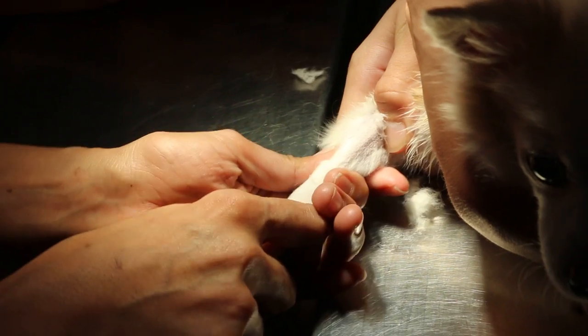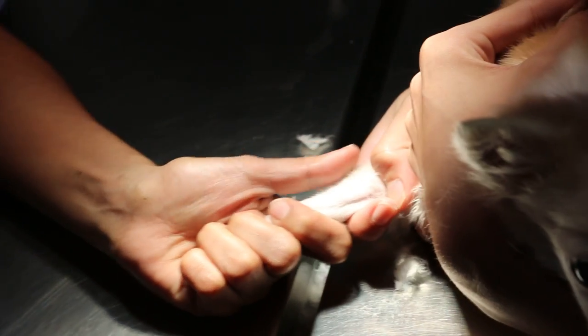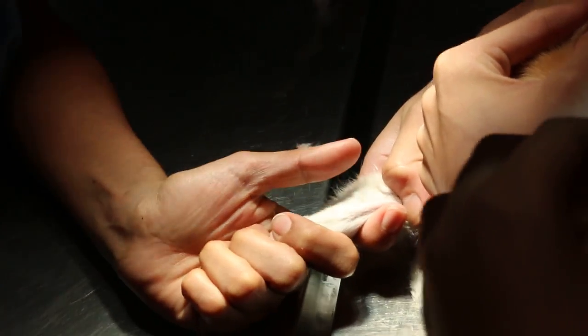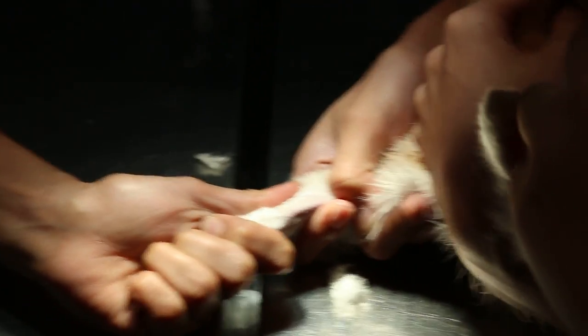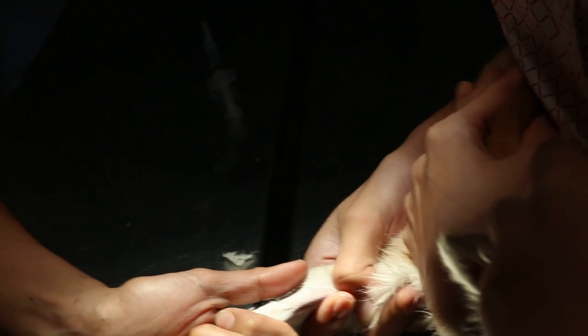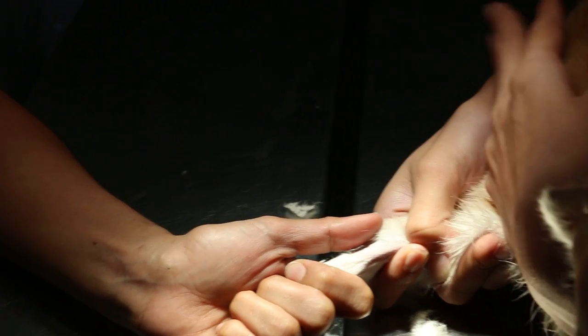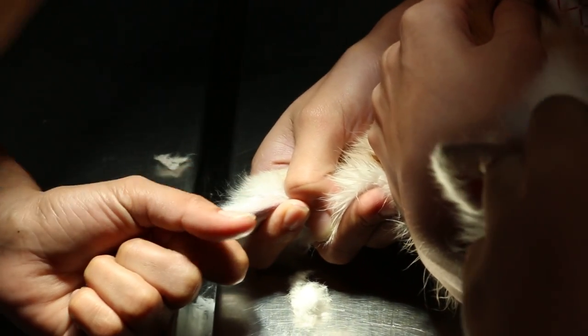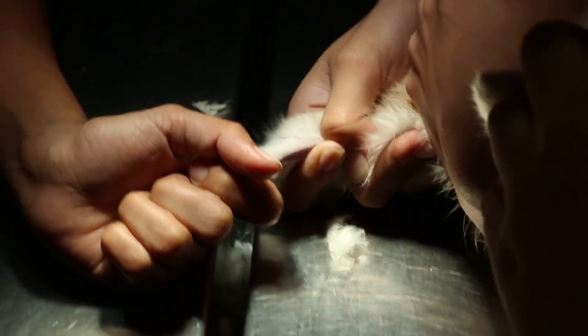Make sure the dog doesn't move, because if the dog moves the catheter will come out. Shhh, it's okay. Close to your body — so always pressure onto it. Get ready everything first, including the syringe. To inject in. She puts the catheter in first. With the catheter in, you can inject other drugs IV.